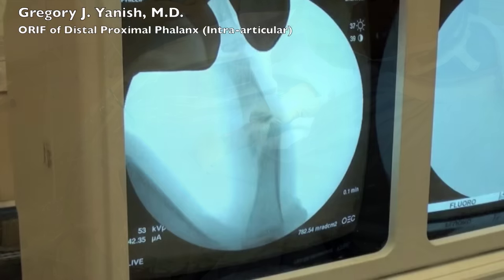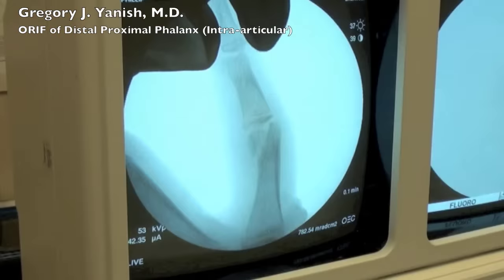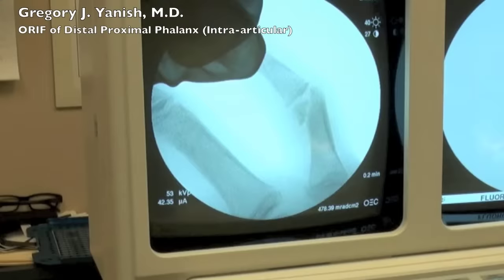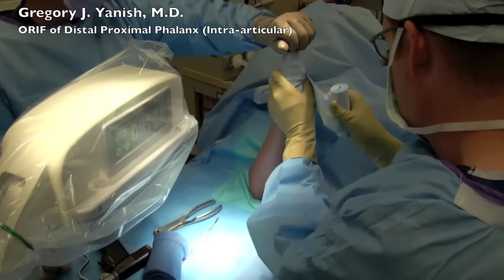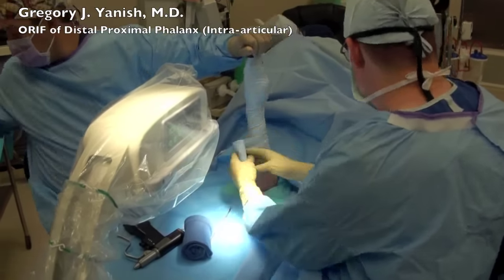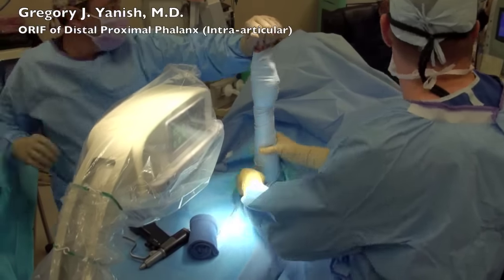This child presented to the office quite late after his injury. He was approaching four weeks on presentation, and this is an extremely difficult fracture to fix. The child continued to play in sports and heavy activity, and has created some erosion at the fracture site.